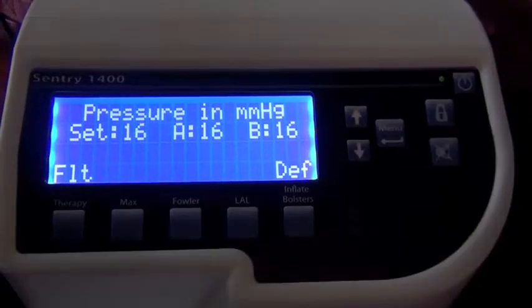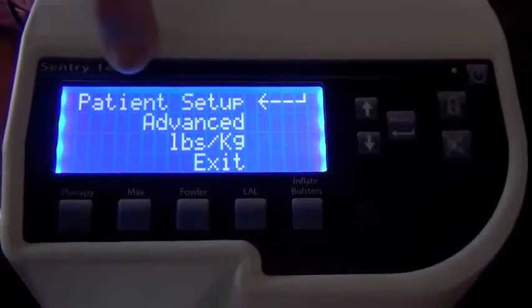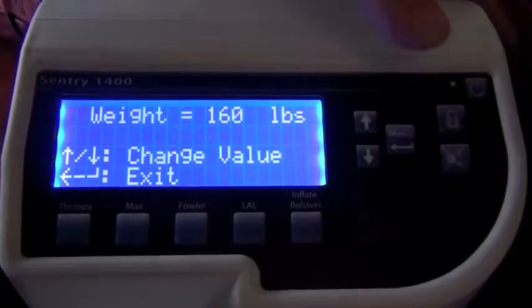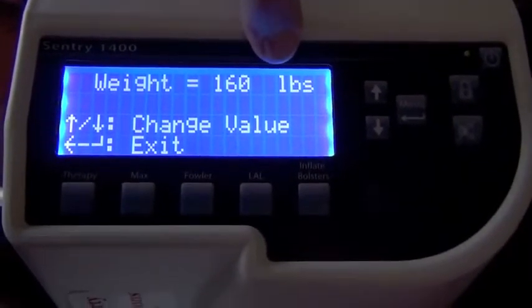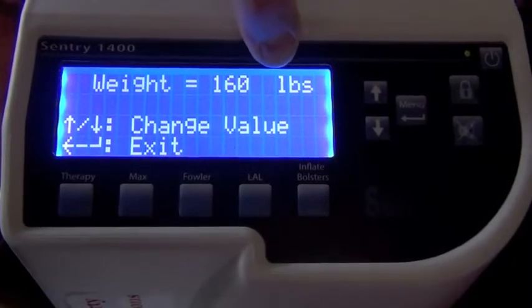the first thing that we do when we're setting the system up is we go to the menu button. By pressing the menu button, our first choice is patient setup. If I push the button again now, it allows me to enter the patient's weight. In this particular screen, it's in pounds. We have the ability to choose between pounds and kilograms.